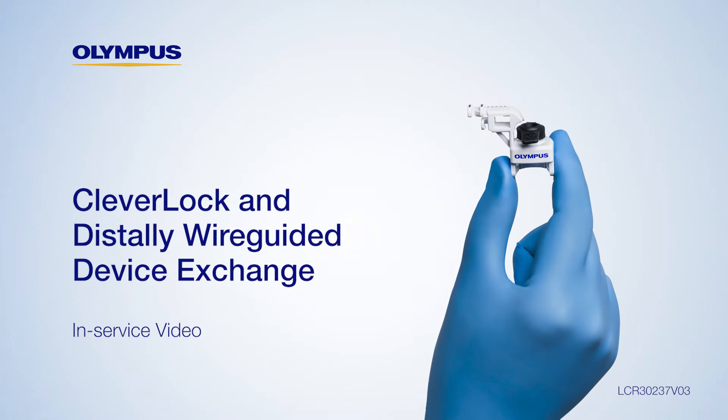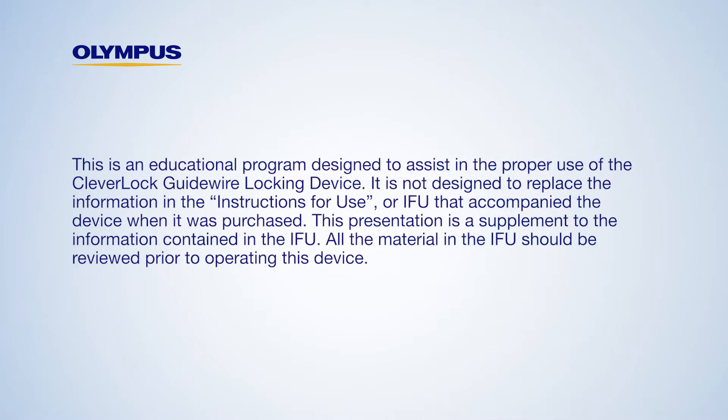Welcome to the CleverLock and Distally Wire Guided Device Exchange in-service. Today we'll review how to attach the CleverLock Guidewire Locking Device and lock two guide wires simultaneously. This educational program is designed to assist in the proper use of the CleverLock Guidewire Locking Device. It is not designed to replace the Instructions for Use (IFU) that accompanied the device. This presentation is a supplement to the IFU, and all material in the IFU should be reviewed prior to operating this device.